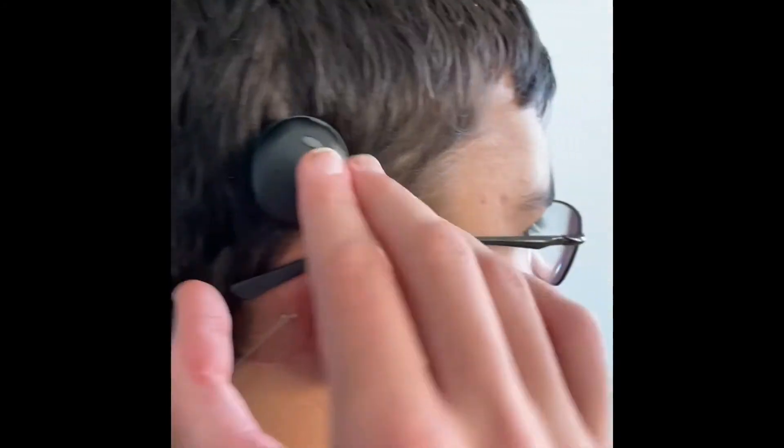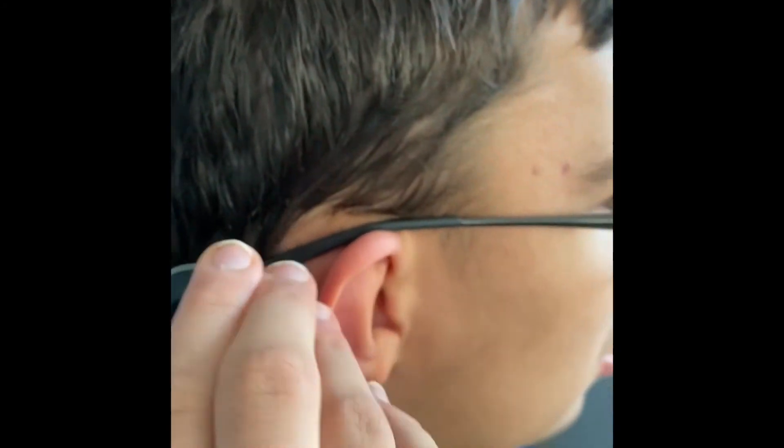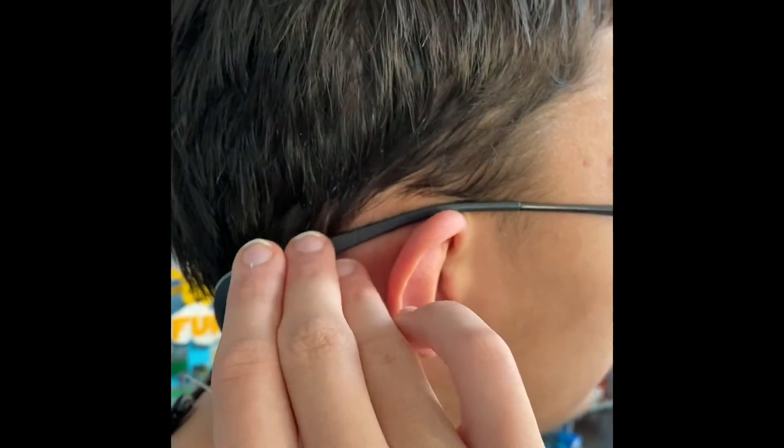This is the Osia right here. You can barely see it. I want to show it up close. As you can see, this is the magnet.